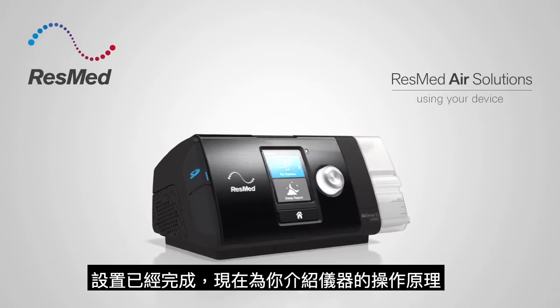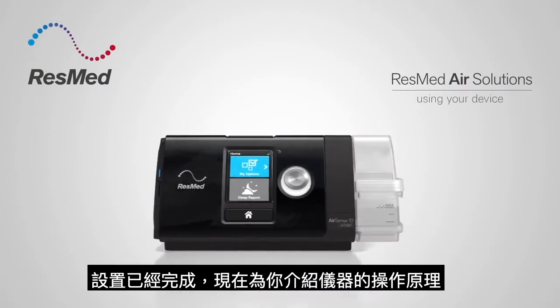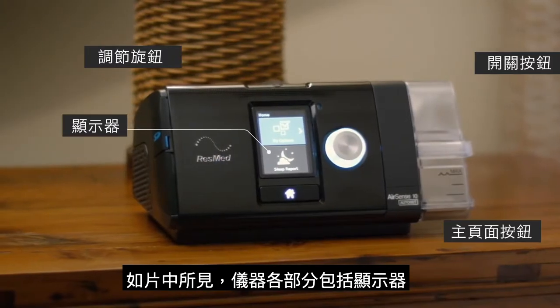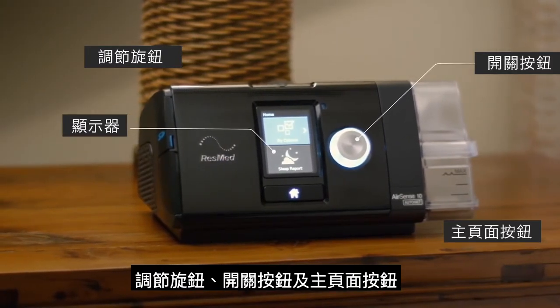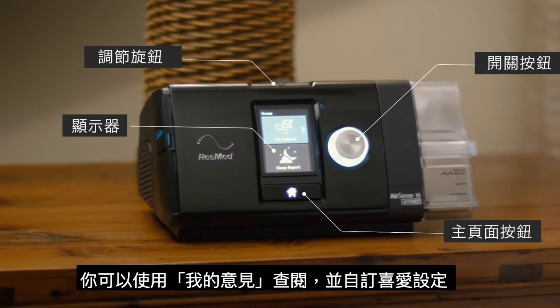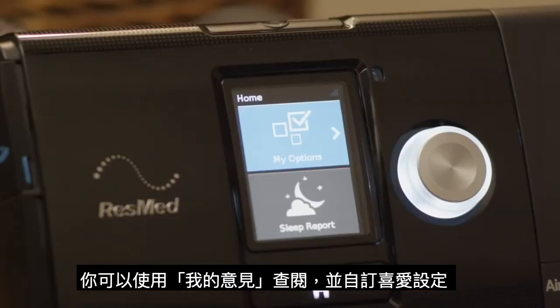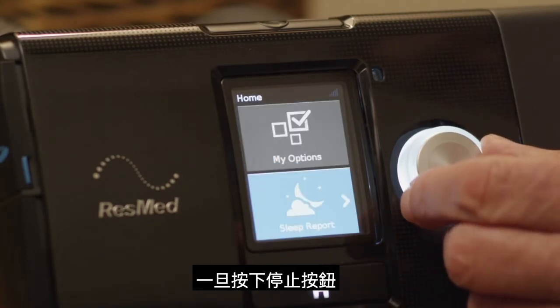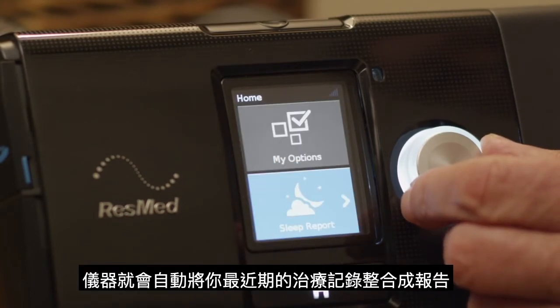With your device set up, it's now time to find out how it works. You'll see it has a display screen, a navigation dial, a start-stop button, and a home button. My Options let you view and personalize your comfort settings, while Sleep Report automatically generates a summary of your last therapy session when you press stop.